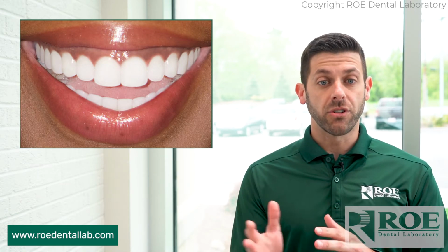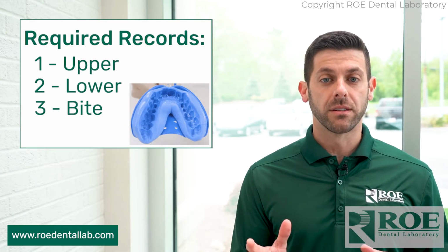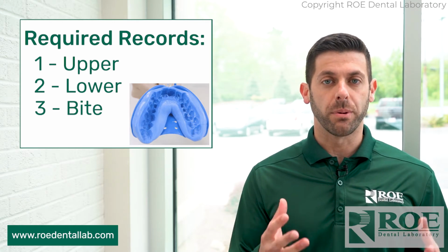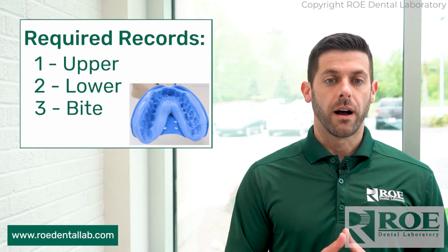So once they've accepted treatment, then of course we want upper, lower, and bite records. And you can also send a study model from there as well. It'll of course help us with the designing of the new veneers, but not mandatory.